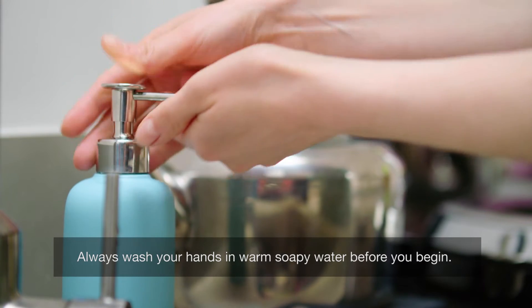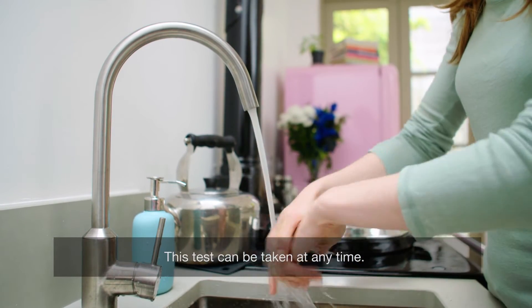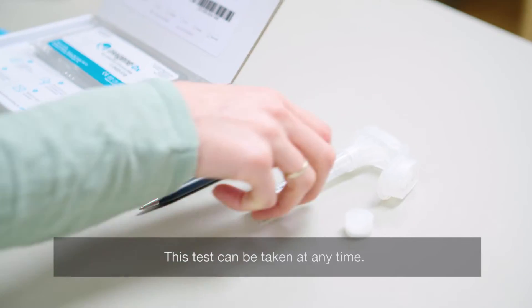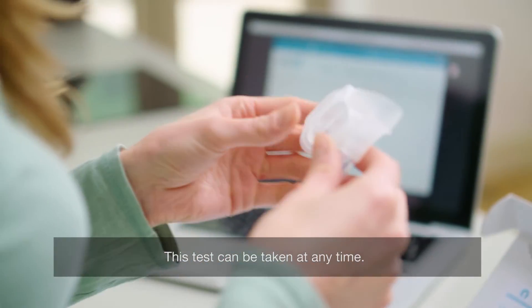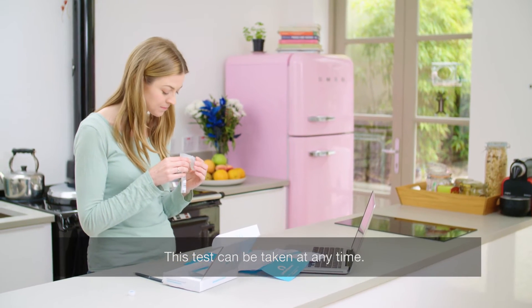Always wash your hands in warm soapy water before you begin. Before collecting your sample, do not eat, drink, smoke, chew gum, brush your teeth or use mouthwash for at least 30 minutes.